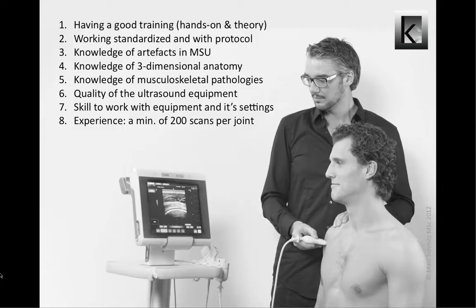The high diagnostic value of ultrasound is strictly related to a few important criteria. MSU's diagnostic accuracy is not profession dependent, but user dependent. Anybody can do it as long as they fit the criteria described on this slide. The physiotherapist seems one of the professions who are most suitable with their background in musculoskeletal anatomy, pathology and examination. But only as long as they use MSU a lot, since there is a long learning curve. This goes for every profession.